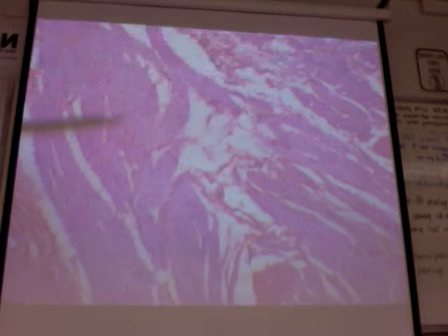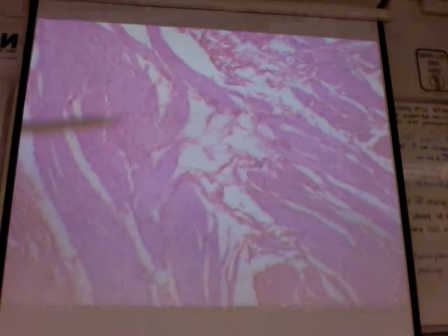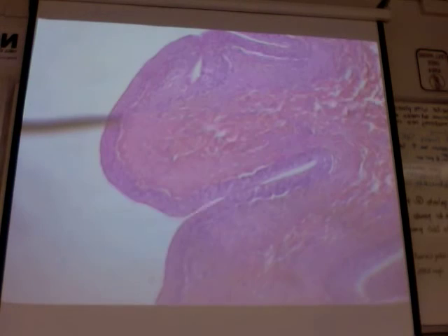The muscular wall is back in this region here. It's called the detrusor muscle. It's smooth muscle that, the bladder is a very muscular organ, so to speak, and the detrusor muscle just gives it shape. So it fills with urine, and the epithelial tissue sort of flattens out. So let's go back to the edge here and look at the epithelial tissue, and then we'll be done.